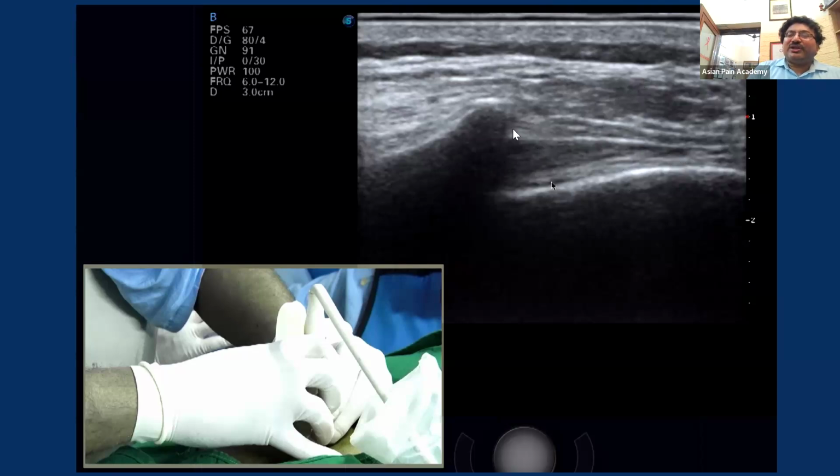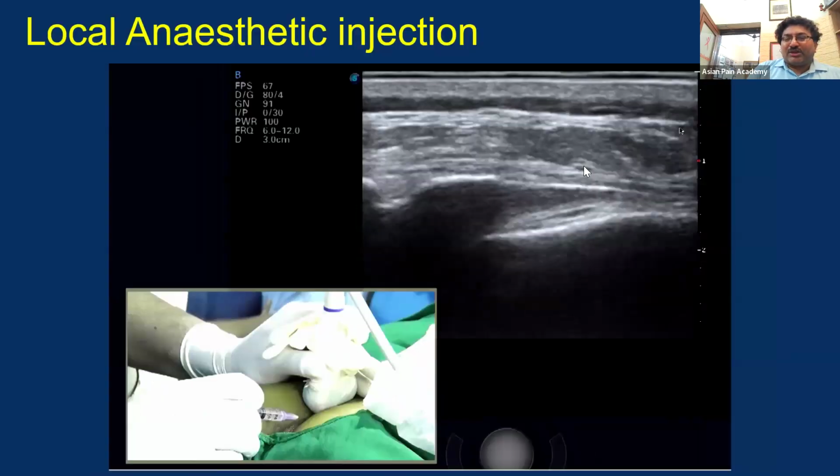The reason behind it is that when we are doing the ultrasound-guided caudal epidural only, there is a possibility that our needle tip might go inside a vessel. If it is higher up, we will not be able to see that. But if it is just after crossing here, the number of capillaries is less, and we'll be able to see that the fluid is moving up. So that is the difference while doing the ultrasound-guided caudal epidural.